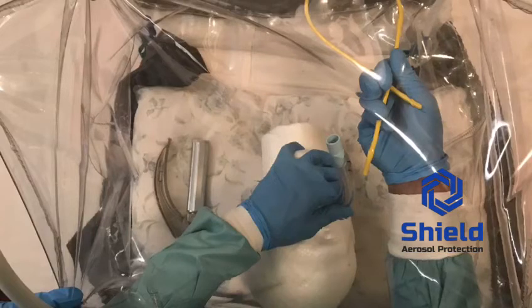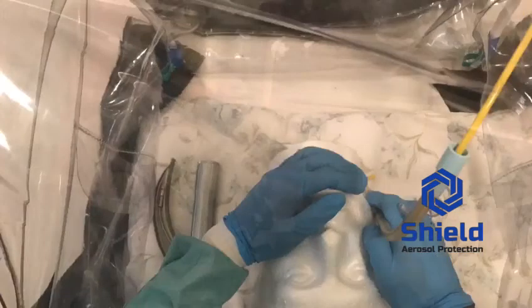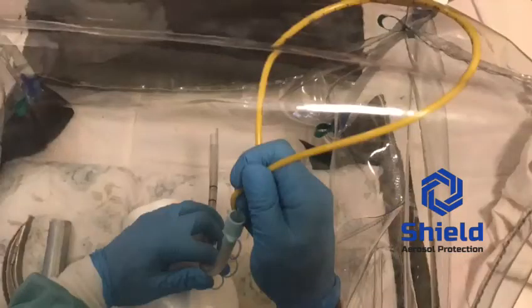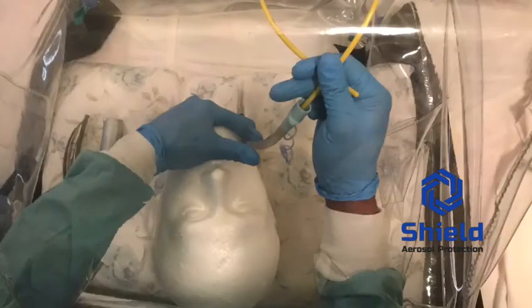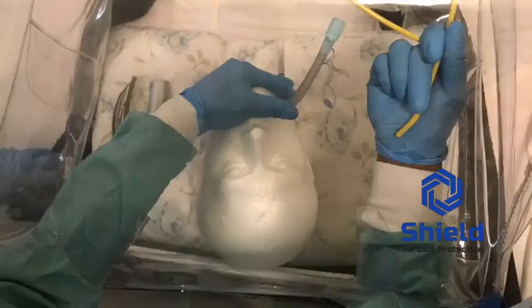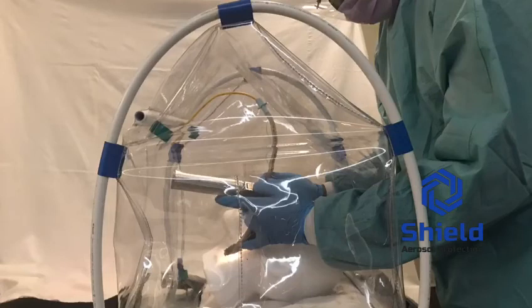The stills show this being done from the bird's eye view and from the lateral side to ensure that a reasonable view is demonstrated of the use of a bougie under an AerosolShield tent. It is not recommended that any part of the tent is cut because of the collection of expired air and droplets in the roof of the tent. The use of the side flaps, the front flaps and the horizontal flap are adequate to position and insert a bougie in a tracheal tube.